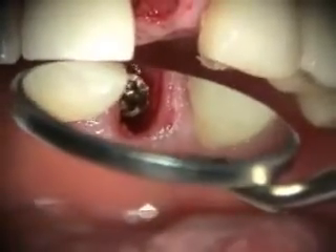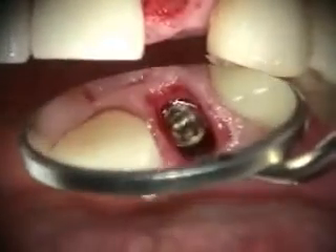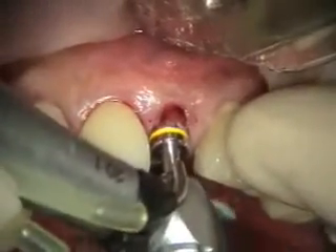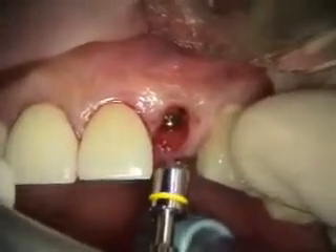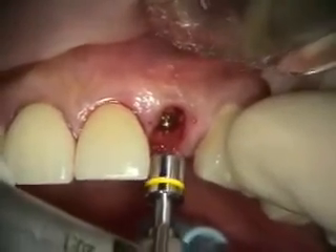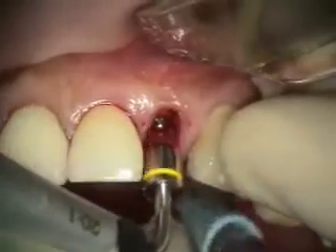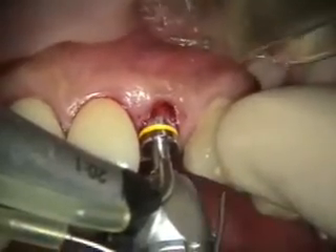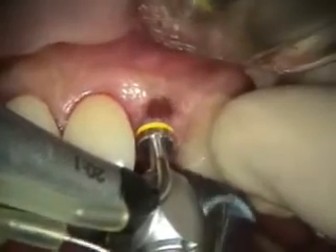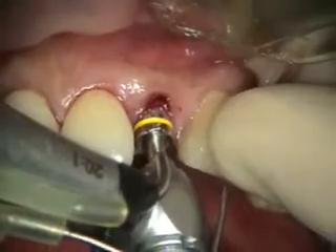Just to make sure that our abutment flare is going to be accommodated, we're going to profile the bone. This is the BioHorizons system where there's a guide that goes into the implant, and normally to get past the gingival margin we go in reverse. But this is going past so we can just go forward.